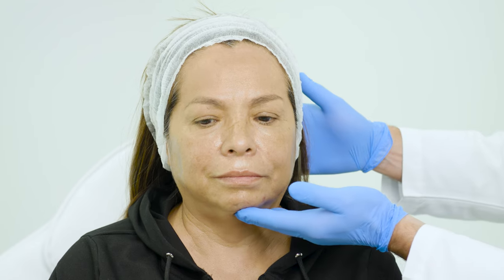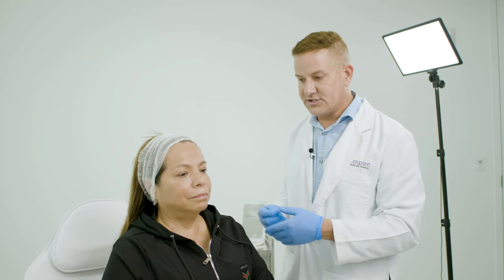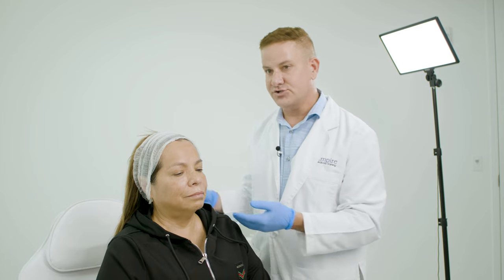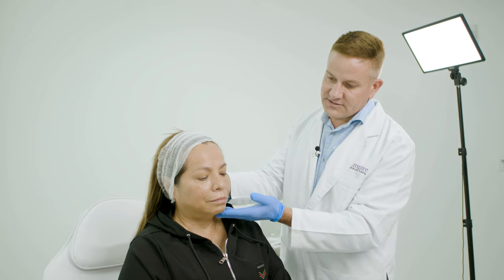Patients may respond in as little as one treatment, or they may need a series of treatments. We discuss that up front with PDO threads that they may need a series. This is also an area where you can do combination therapy. There are a lot of different energy-based devices or lasers that you could combine with your PDO threads, where you do the energy-based device first for tightening.